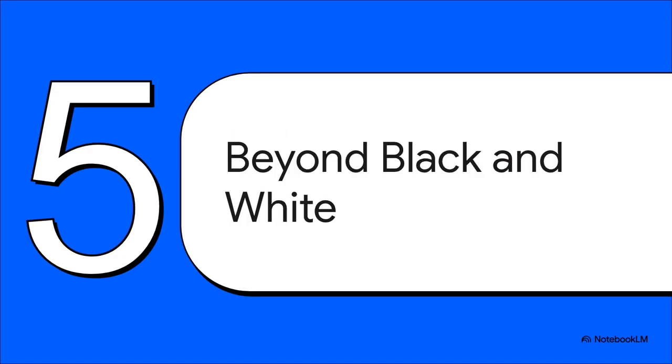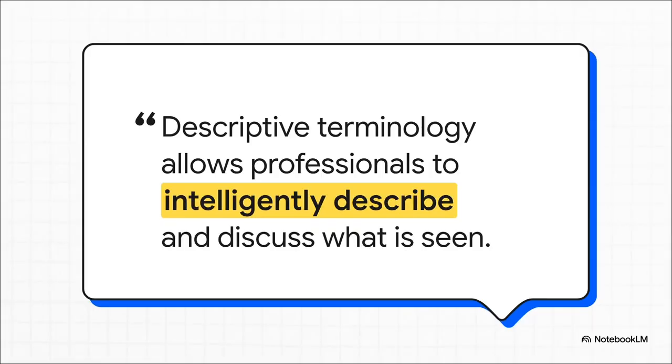So, as we wrap up our investigation, it becomes really clear that reading these images is an incredible skill that goes way beyond just seeing shapes on a film. And this is why it is so critical. This shared language isn't just academic jargon. It is a vital tool for patient safety. It makes sure that every single professional, from the hygienist to a specialist across the country, is looking at the same evidence and speaking the exact same language.